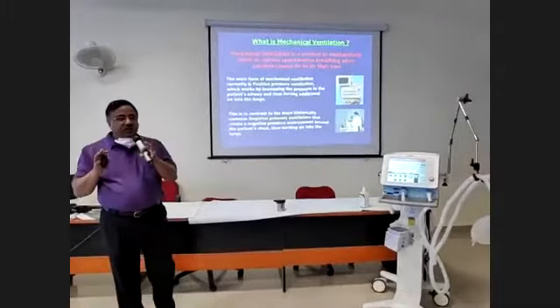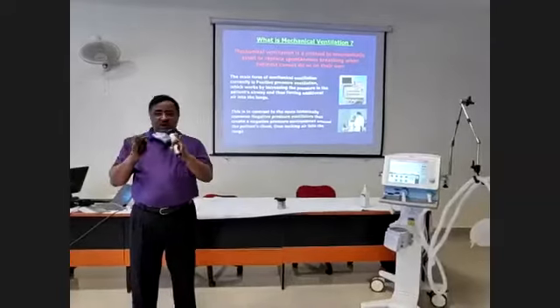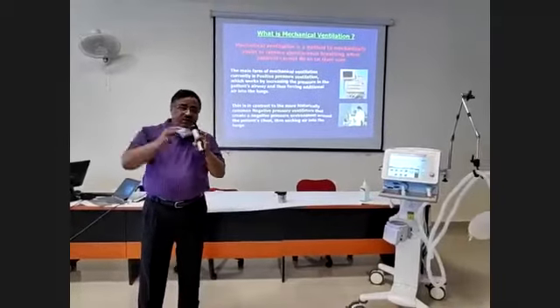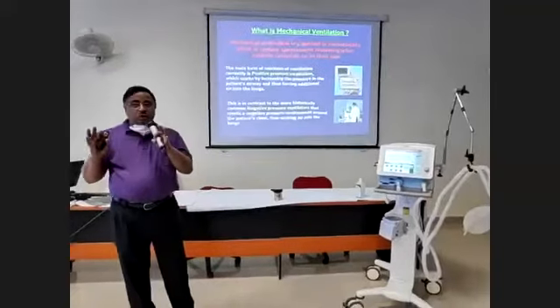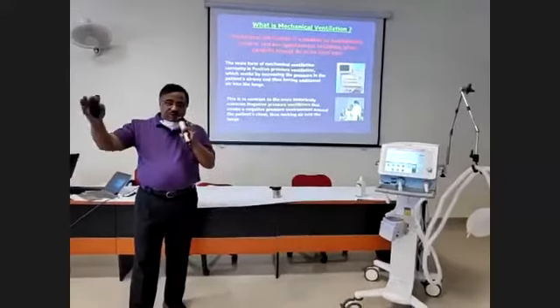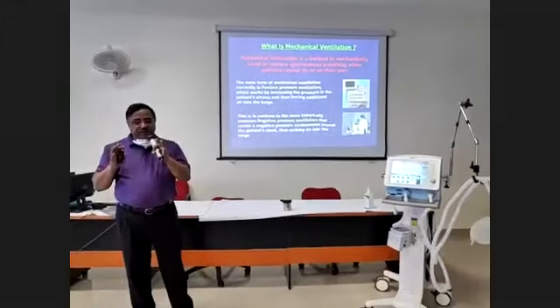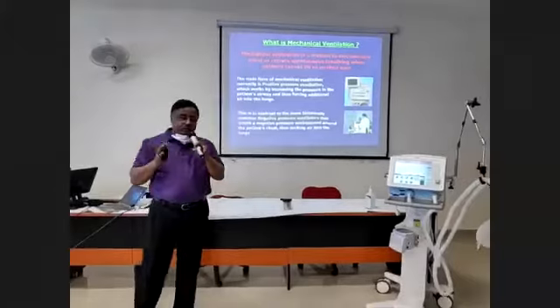So that is why understanding patient-ventilator synchrony is also very important whenever you have a patient on a ventilator. It's not that you just connect a patient to a ventilator and presume that you have done your job. No, that is just 1% of your job. The remaining 99% stays when you are working with a ventilator and the patient is in place, and that is a very tedious and a very intelligent job which needs to be done.